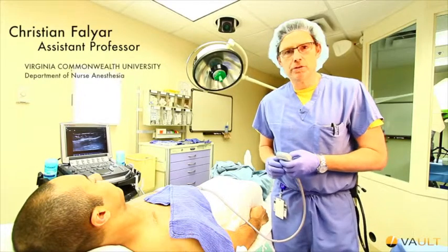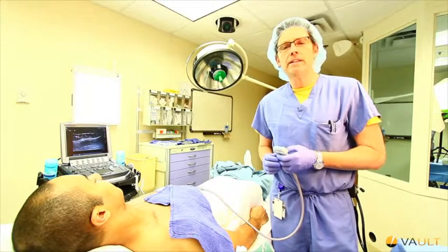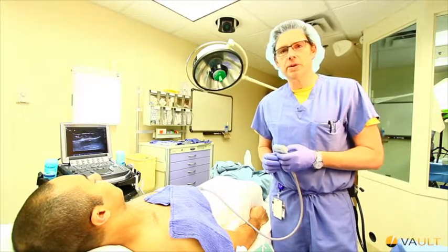Good morning, my name is Christian Falyar. I'm an assistant professor at Virginia Commonwealth University's Department of Nurse Anesthesia. Today we're going to talk about ultrasound-guided upper extremity blocks.